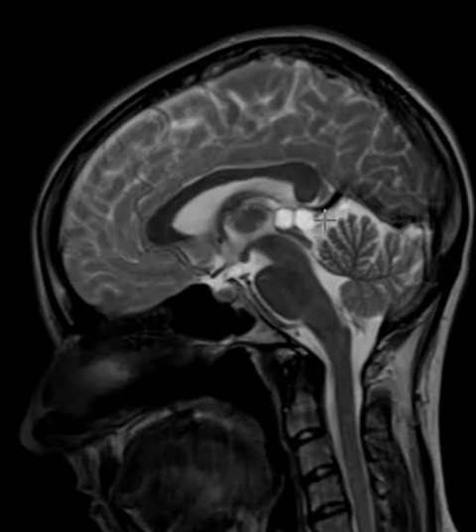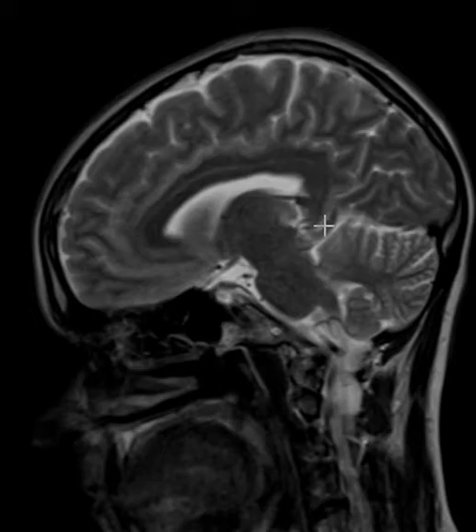And you can give contrast. Usually the contrast will cause a thin rim of enhancement around the periphery. Sometimes it can be a little bit nodular, but usually it's a thin rim of enhancement, and delayed imaging with contrast. If you accidentally don't image right away, the contrast can infuse into the cyst and look like a solid lesion.